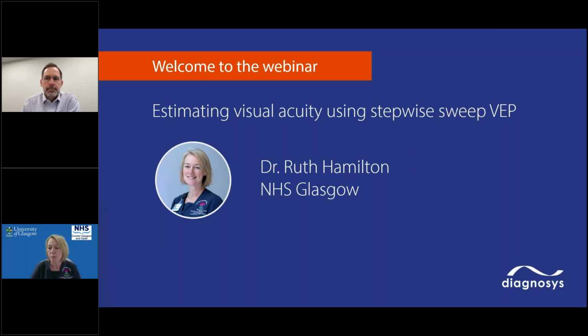But back in those days, we were frequently testing babies and children in the visual electrophysiology clinics, and the clinicians really wanted to understand what sort of level of visual acuity the child had. And the only method we had at our disposal was using transient VEPs to lots of different check sizes. Now, with transient VEPs, obviously each one has to be reproduced. Sometimes the VEP is really small, so you need extensive averaging, or the EEG is really big. And often the children had different clinical difficulties, morbidities, learning problems, and so on. So their fixation and their attention could be really erratic.